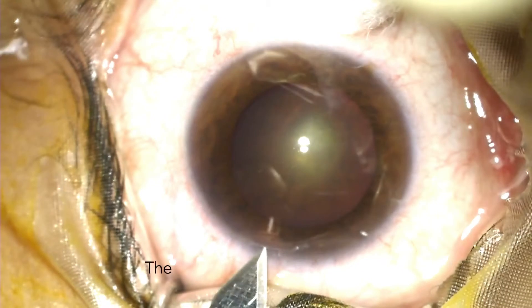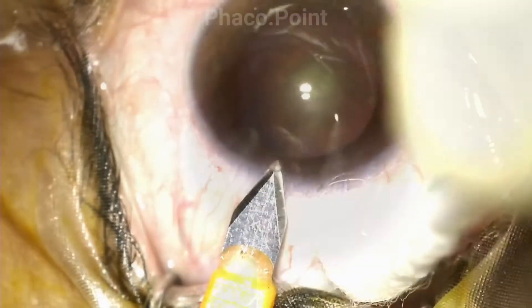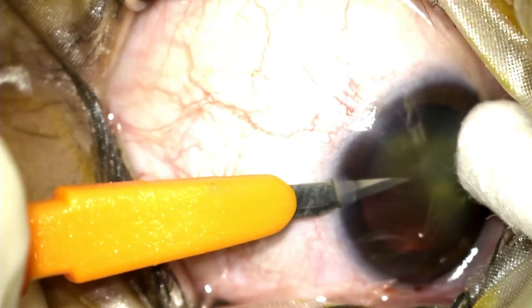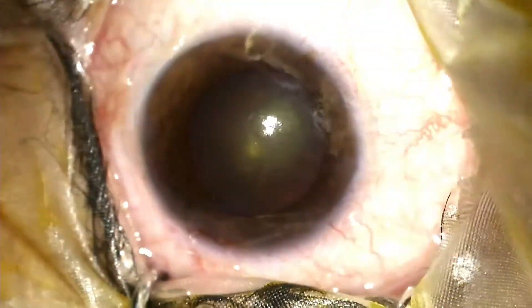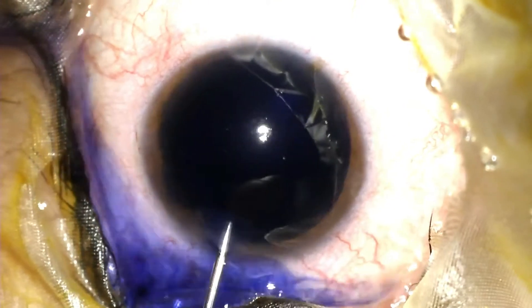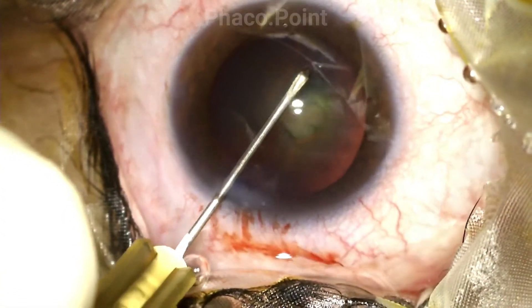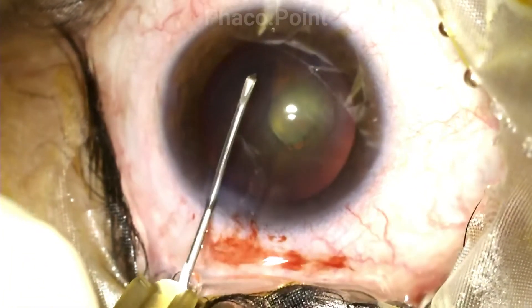Here's a patient with a grade 2 nucleus sclerosis with a suspected posterior polar cataract. It is of utmost importance to always remember that your three initial steps — that is, wound construction, the capsulorhexis, as well as the hydrodissection and rotation of the nucleus — should be flawless. Following the meticulous construction of the wounds and staining of the anterior capsule, I now proceed to perform the capsulorhexis. I ensure that the rhexis is no more than 5 mm because this is a suspected polar cataract.